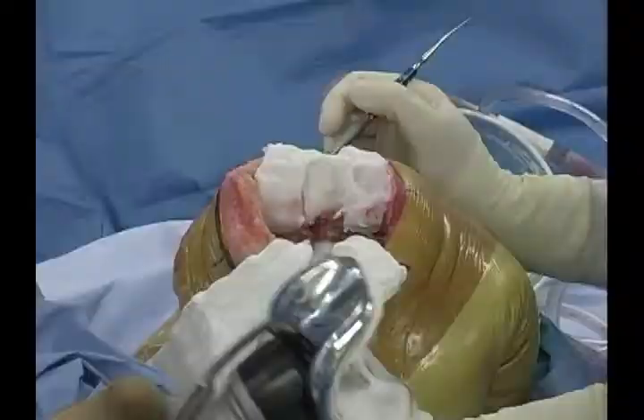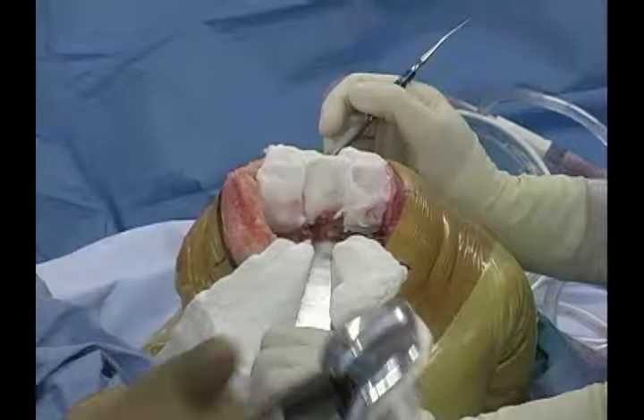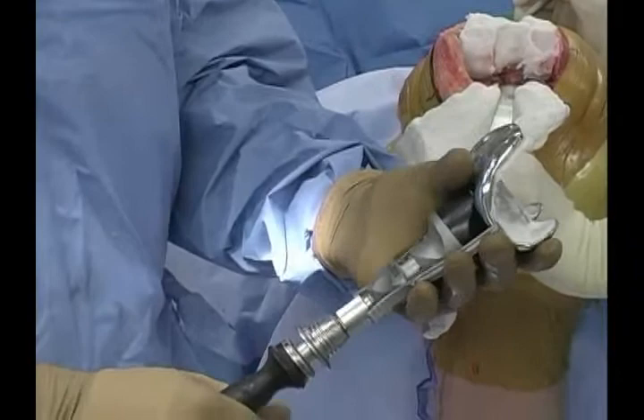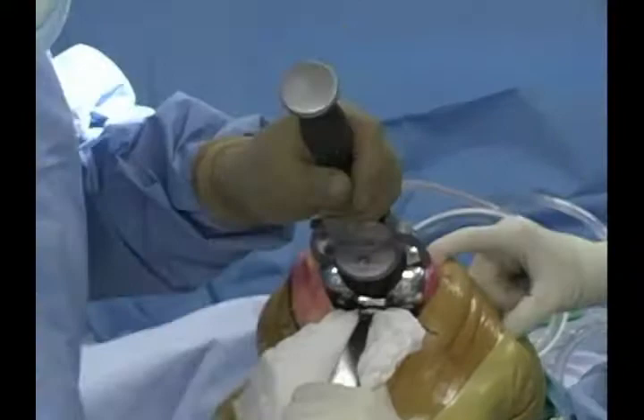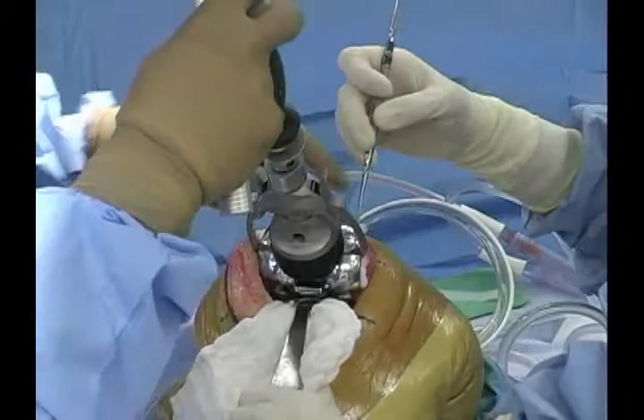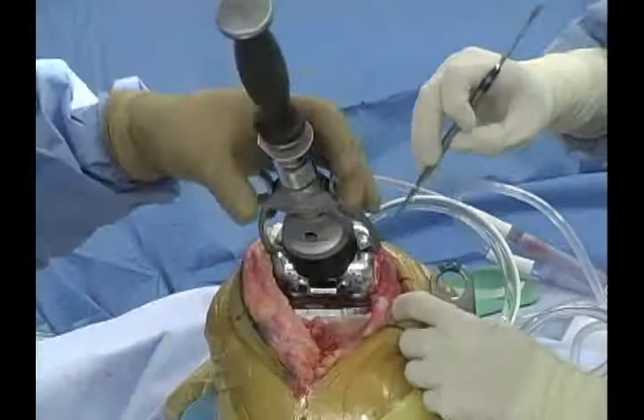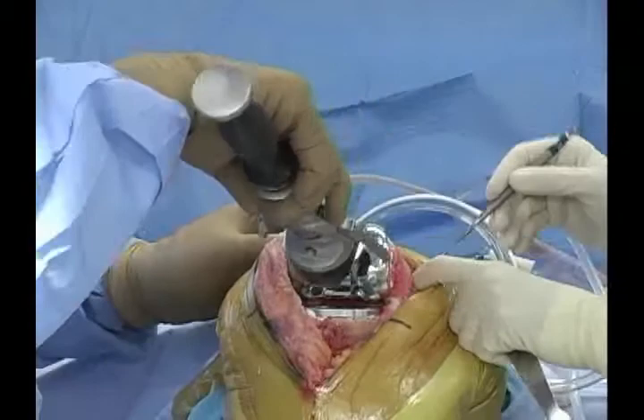This is a new inserter used for femoral insertion — it's a rocking inserter and very easy to use. The implant tightens to the inserter by twisting the handle, and then you impact it into place, allowing you to translate and position it where you like. Extraction is simple: just loosen the handle and squeeze the tongs on the side. The tibial insert is rotated in laterally first, and then we extend the knee.